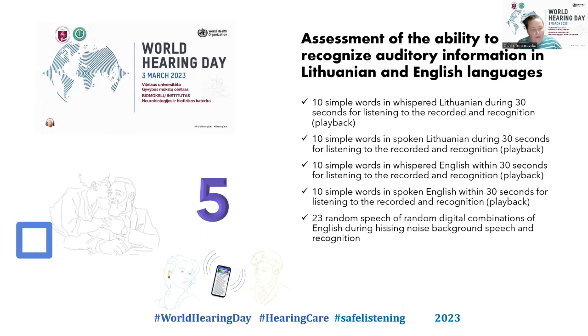The psychological component, how many percent of the information you're familiar with, also plays a big role in finding and reproducing information. That is, by choosing 10 simple words from the speech unit, we can easily calculate quantitatively, in percentages, the recognition ability for auditory information from a standard recording.